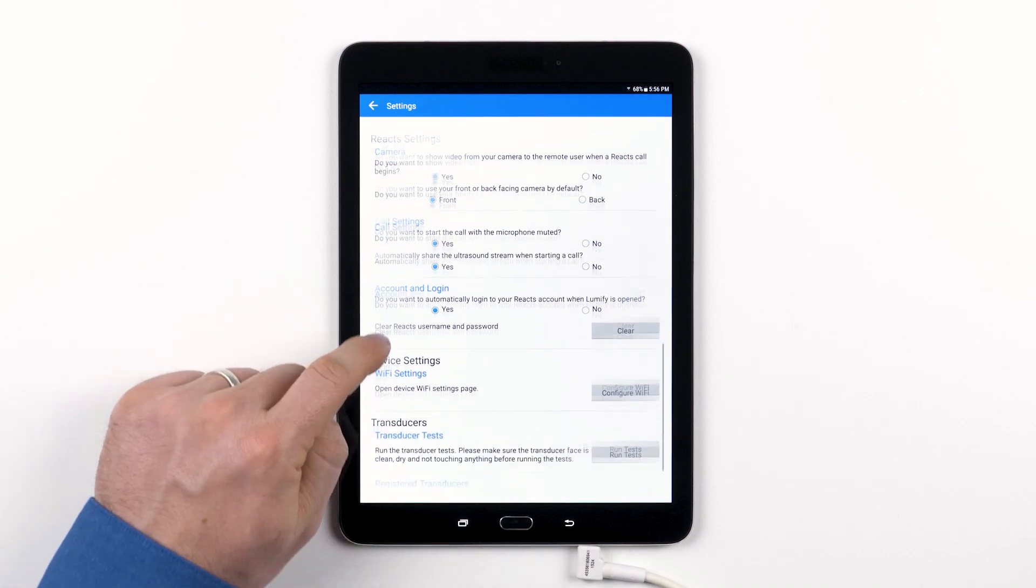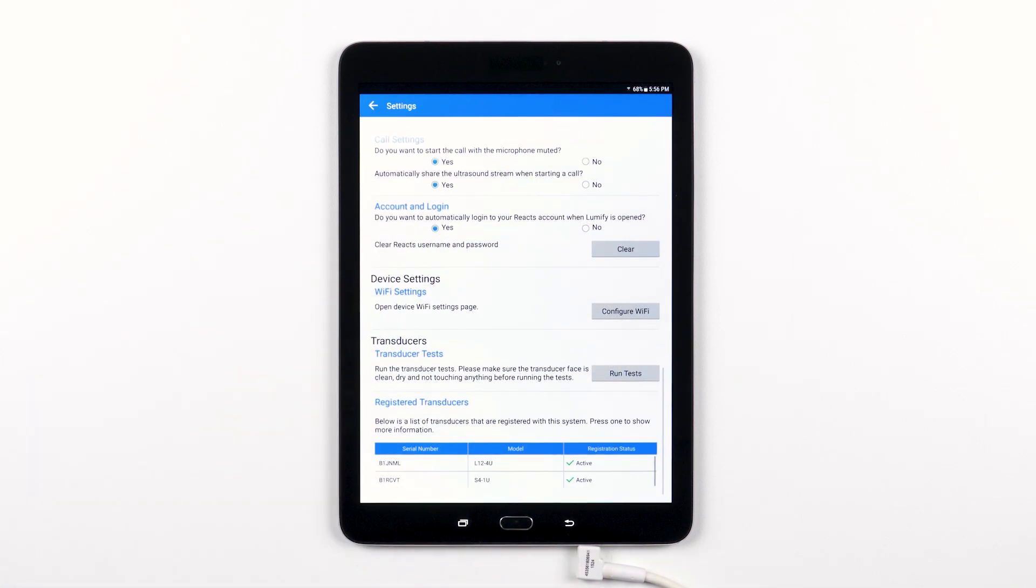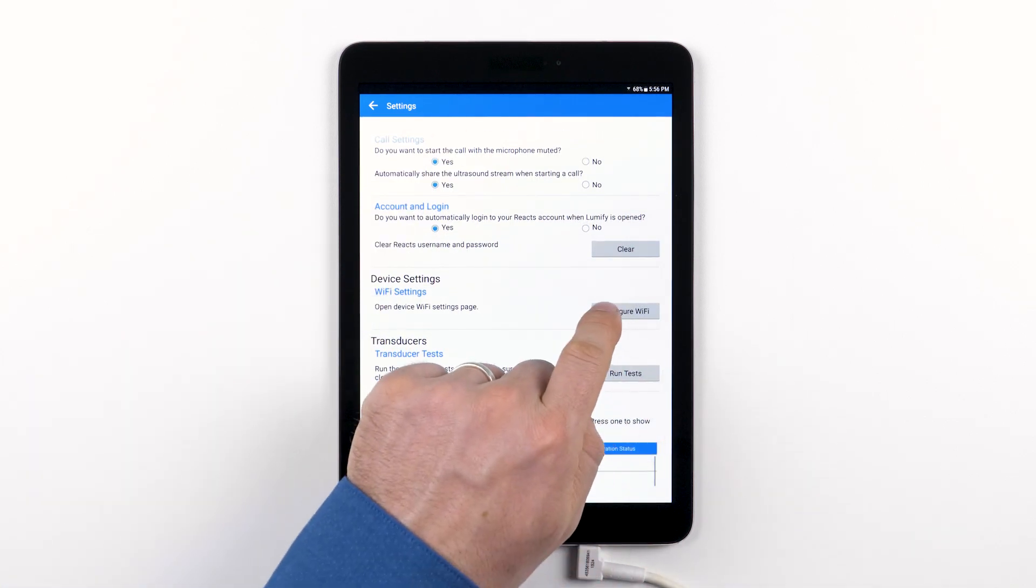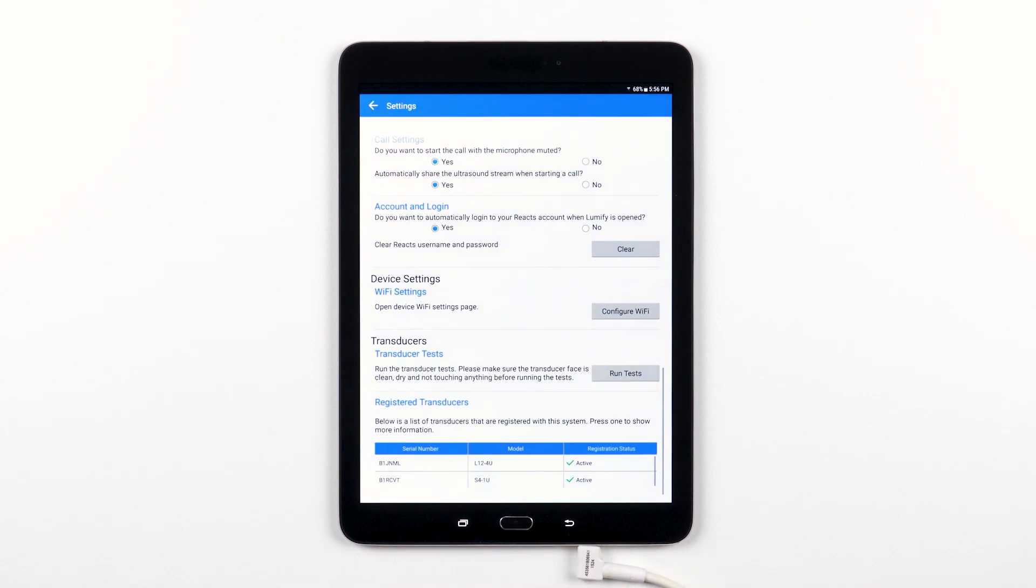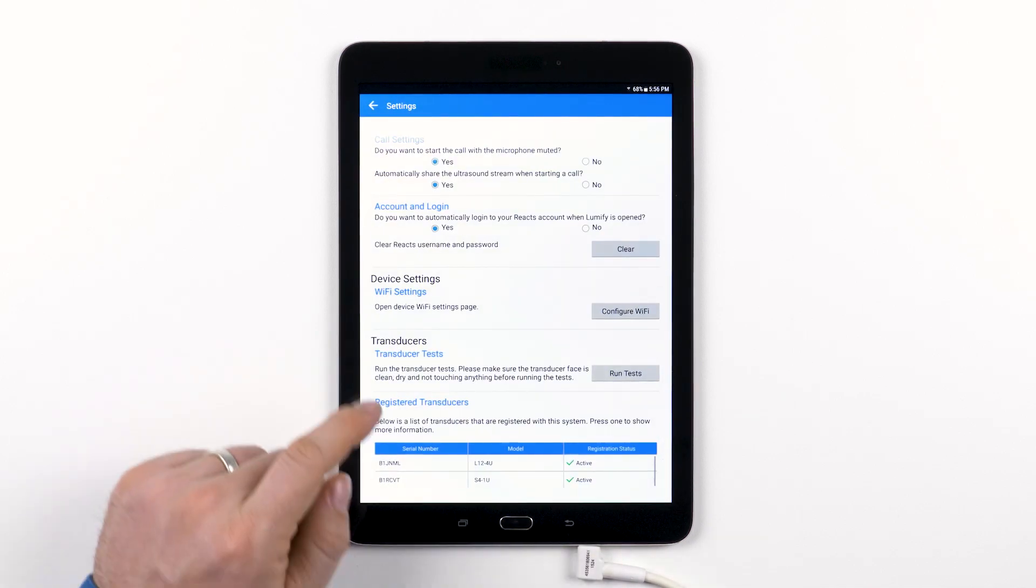The Wi-Fi settings section provides a shortcut to the device Wi-Fi settings page, in case you're unfamiliar with the type of device that you have the Lumify app installed on.